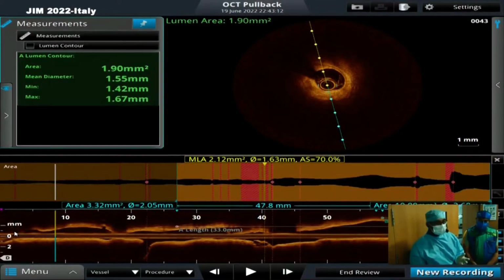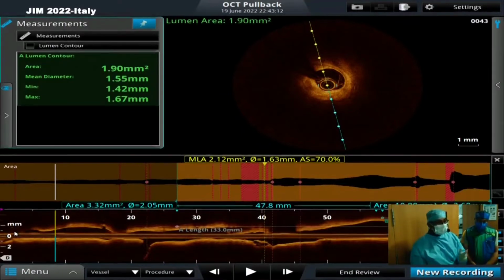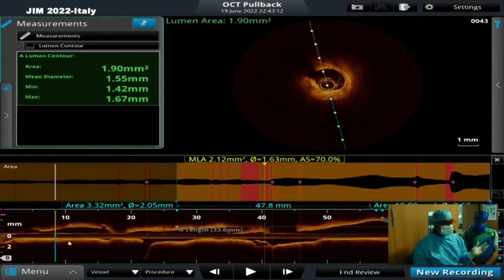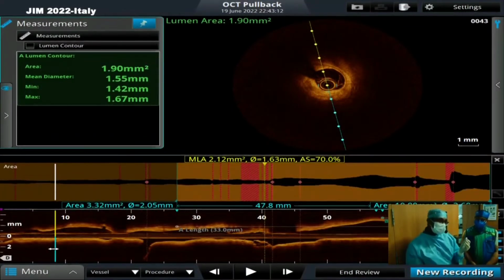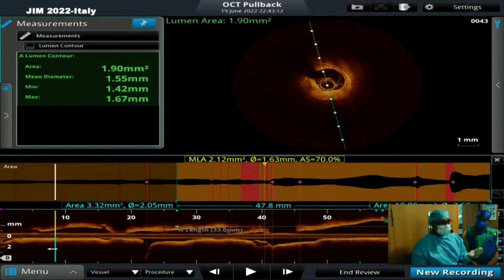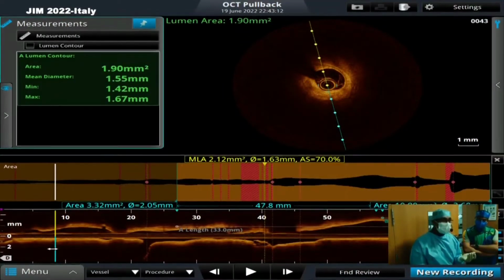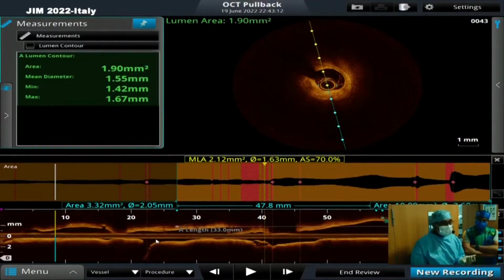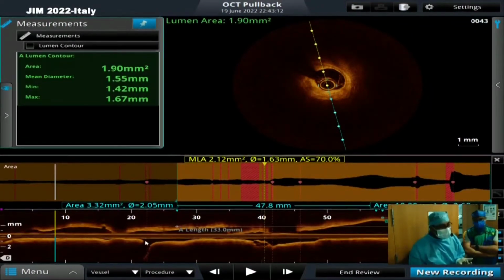If at all we had to stent that particular area, we'll have to put in long stents right from the left main into the most distal LAD. So we felt that this vessel should grow up once we open up the proximal portion. So based on the angiography, the retrograde collaterals, we felt that probably our stent should be parked proximal to the D2, this particular branch.